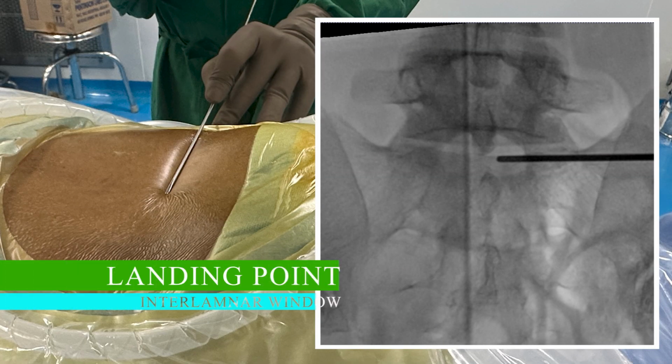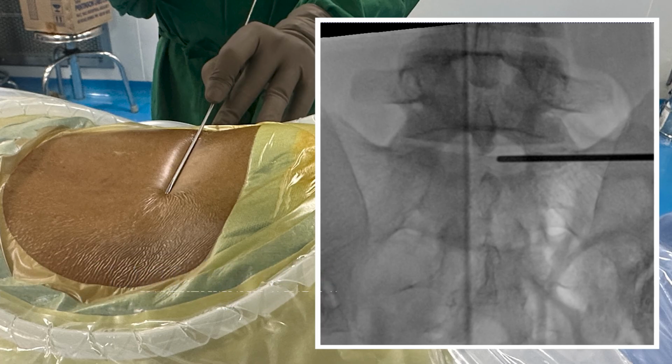The first surgical step in interlaminar surgery is identification of the landing point at the interlaminar window. As you can see in the X-ray, this patient has a wider interlaminar window at L5-S1, so we are not going to do any bony decompression. In such cases, where you are dealing with a wider L5-S1 interlaminar window, the landing point should be in the middle of the interlaminar window, as close to midline as possible.